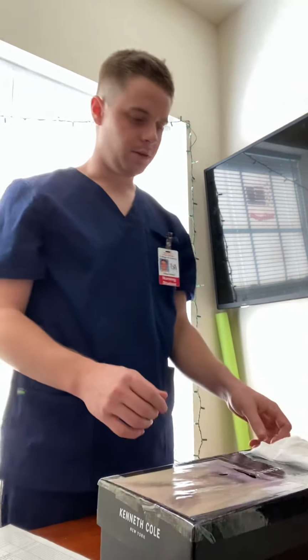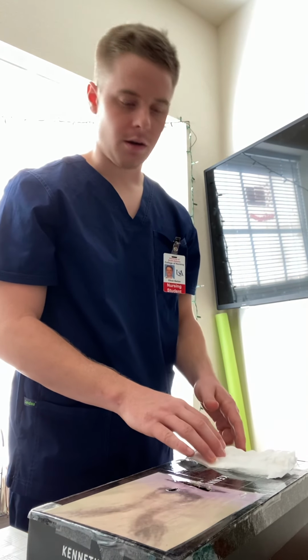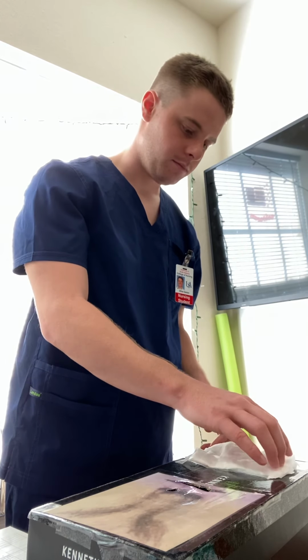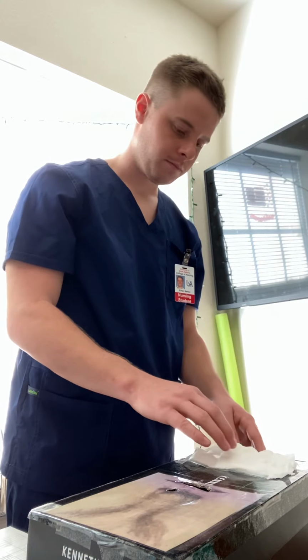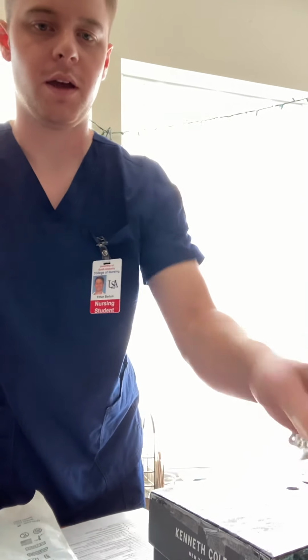So now I'm going to assess through the Tegaderm. So you can see there. Assessing through it, and I'm also palpating around the insertion site. So after I've done that, I'm going to move the camera again, and then I want to make sure that my bedside table is placed closest to the patient, and that is nearest to the site.